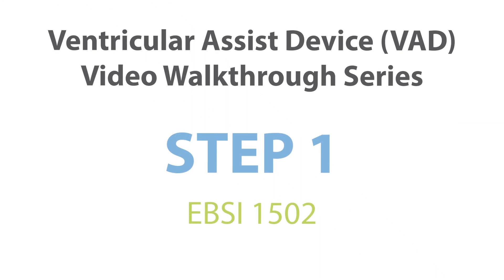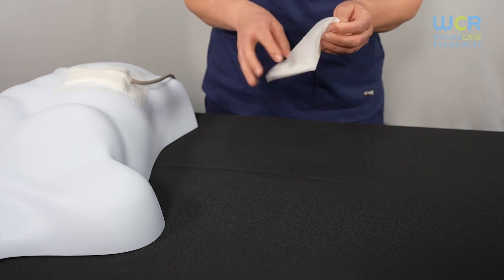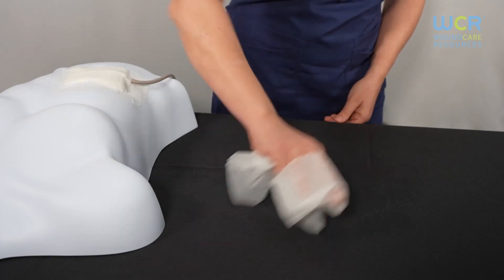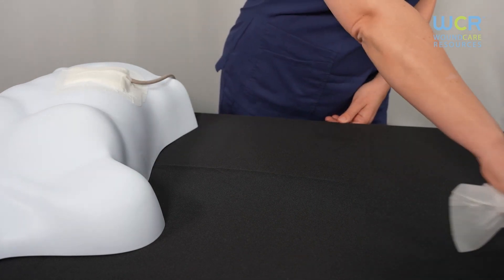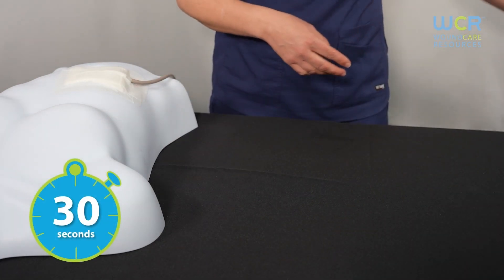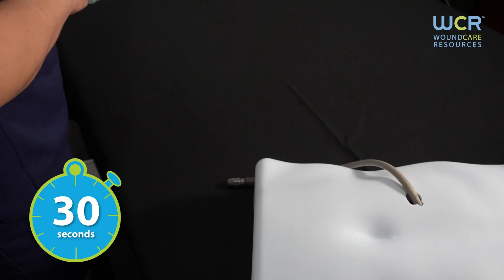The first step is to prepare the area where you will be opening the kit by wiping it down with a sanitizing wipe. Be sure to clean an area that exceeds the size of the drape when completely open, or 18 inches by 26 inches. Allow the area to dry completely before opening your dressing change kit.